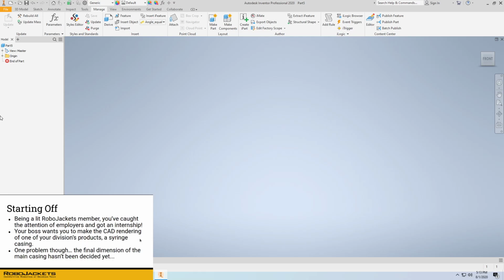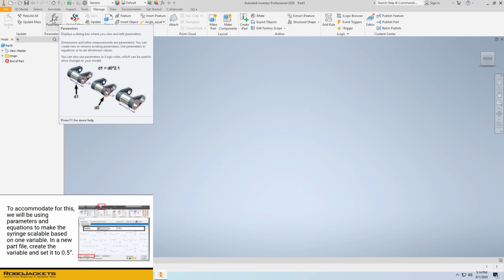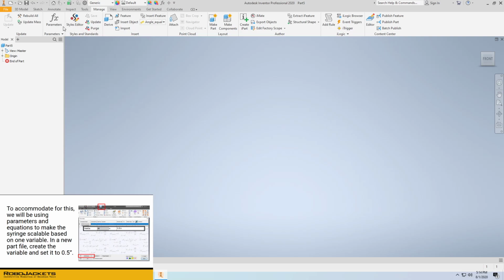The scenario is you've been tasked to create this surgical syringe casing in CAD, with the one caveat that the final dimensions haven't been determined yet. So, to implement that, we'll be using the parametric CAD features. Go ahead and open up your parameters, either using the Manage tabs parameters or the small FX at the top of your screen.